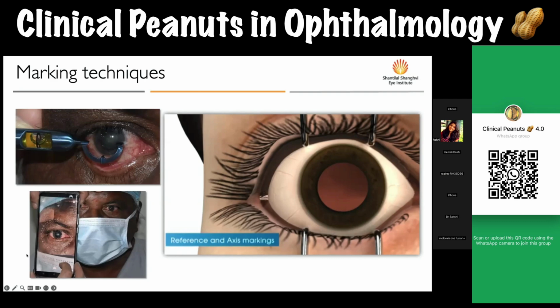And what it does is it connects these dots to a line, and then using the inbuilt gyroscope of the phone, when you enter your intended axis, say that your intended axis of placement of the lens was 160, the app calculates the amount of error that might have been produced and gives you a new axis of placement for when the patient lies down in the supine position.